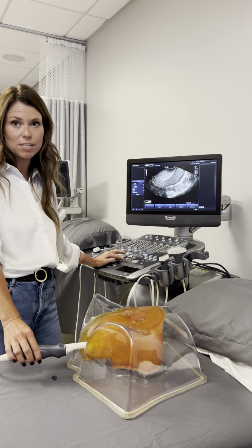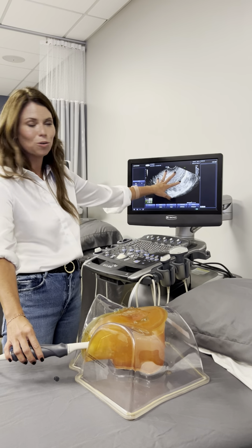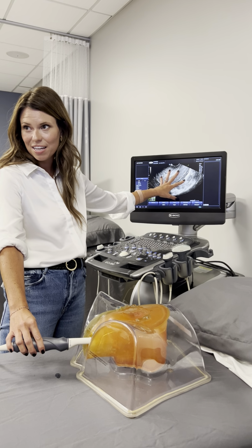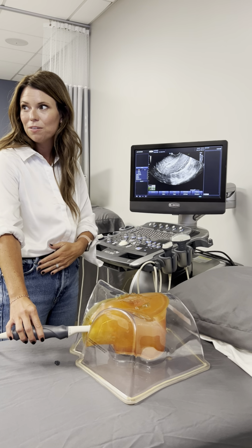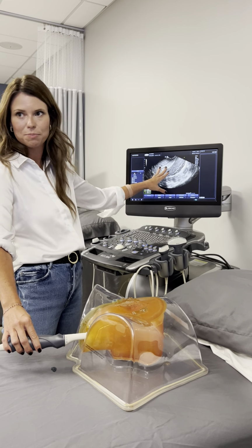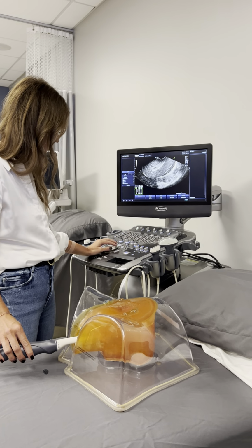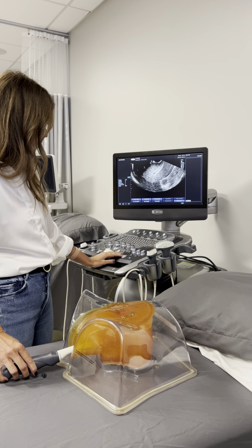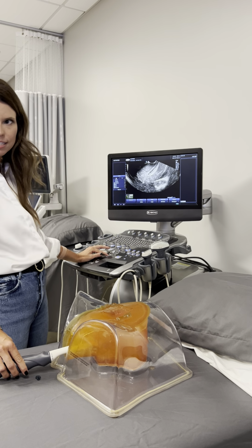Now another test question was, which one's better to measure? It's hard to see the whole uterus on these transvaginals, right? So technically a global view transabdominally is gonna give you the best measurement of the uterus. However, it's not impossible to measure this, and we do it all the time. So you'll measure length, and you measure height, which is from anterior to posterior.